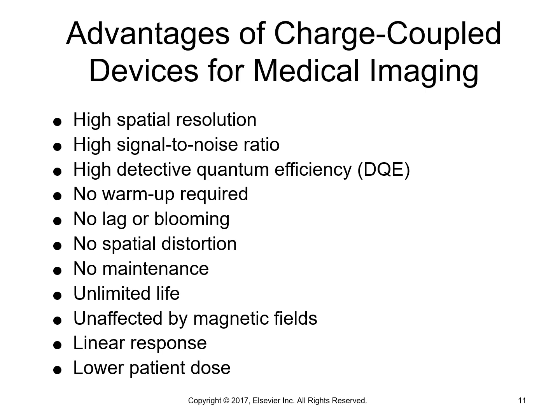So I'll give you a quick example. Cesium iodide indirect DR flat panel, the Canon DR plate that you're used to, it's everywhere. How efficient is that at catching the remnant beam? Somewhere in 60 to 70% typically. It comes in about 63 to 66% is what most publishers say. Okay? And so that's 2/3 of the photons in the remnant beam. Now, how good is that? Well, it's about double as efficient as screen film technology and CR technology.